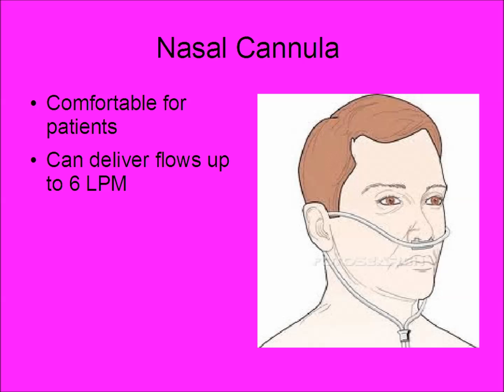The nasal cannula is probably the most used device. It is what you see your COPD patients with going home, which really may not be the safest thing, since this is a low flow device, and with COPD patients you have to be really careful about their inspired FiO2, but it is the most ergonomic product out there.